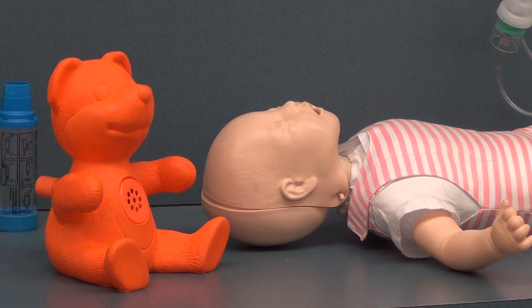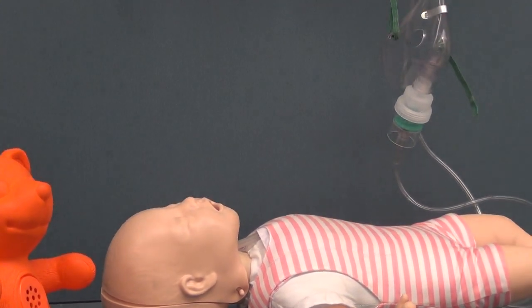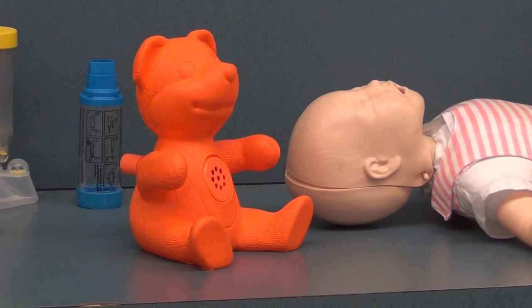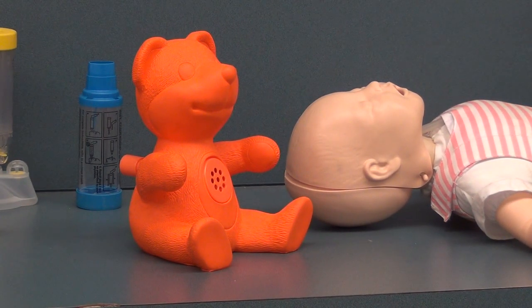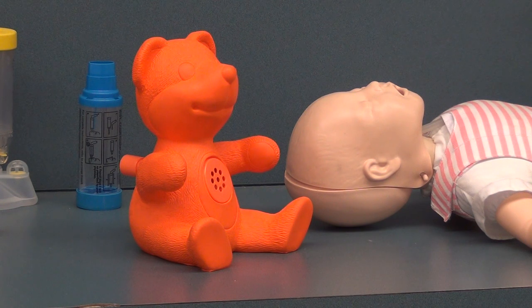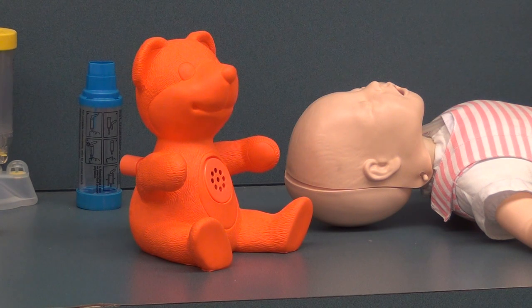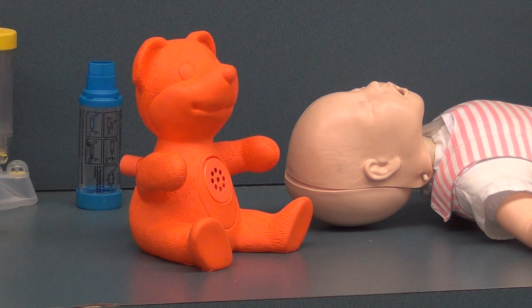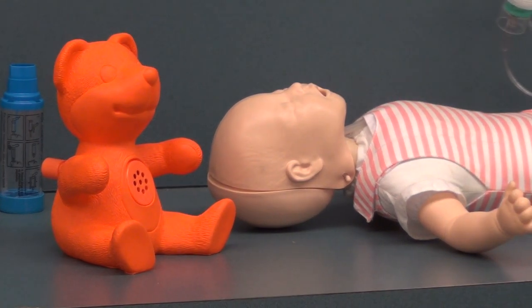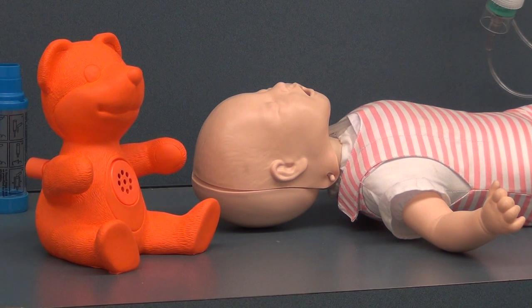There are several ways that we can utilize the blow-by method: using the mask that you see there, some facilities incorporate a device that looks like a teddy bear that helps administer aerosolized medication or provide humidity, or we can use our T-piece that normally comes with the nebulizer setup. I will demonstrate how we would utilize each of the three.